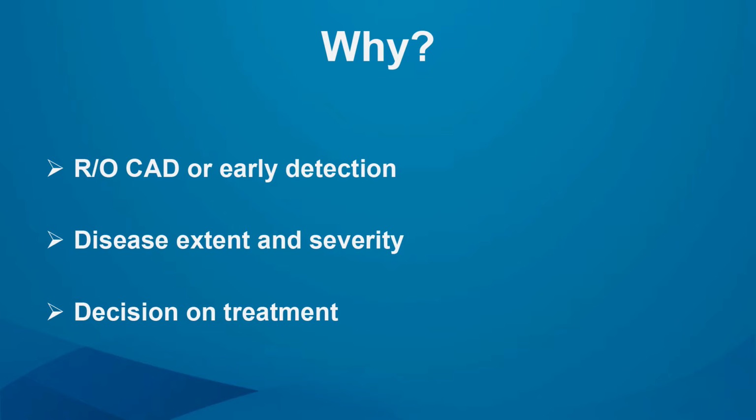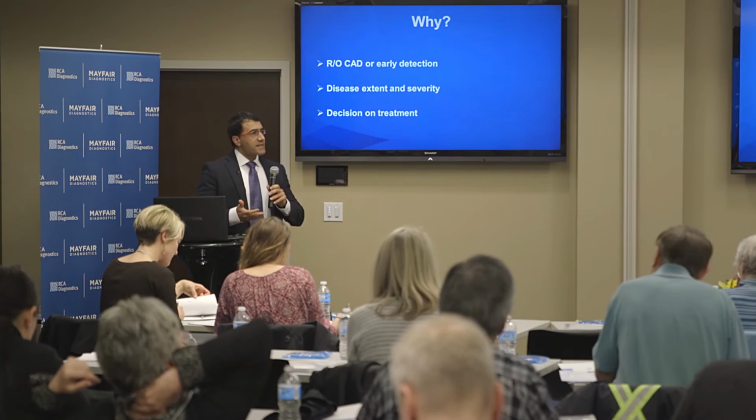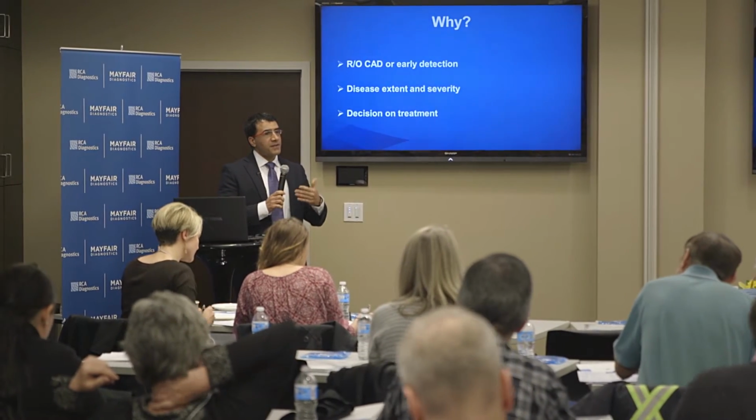Why is coronary CT a good test for patients with suspected coronary artery disease? First of all, it's a very sensitive test. It has a very, very high negative predictive value. So basically, if it's negative, there is no coronary artery disease. So it allows us to do early detection of coronary artery disease.